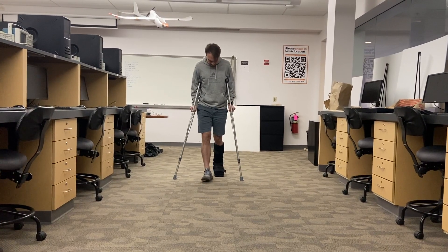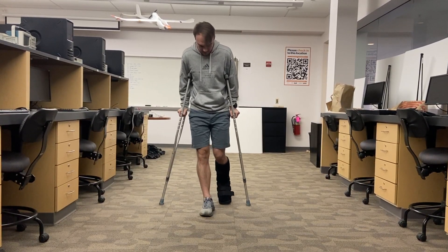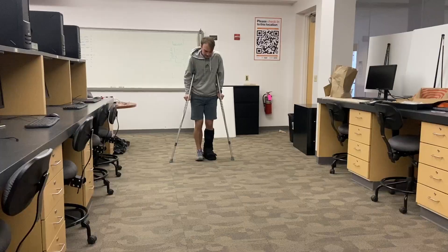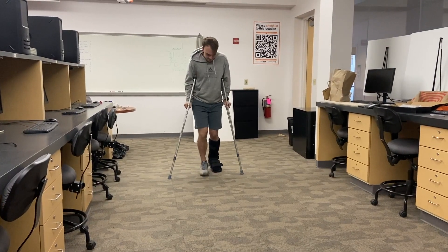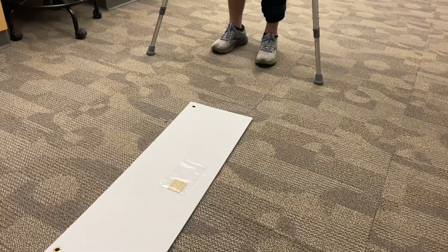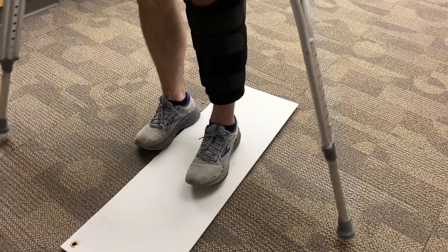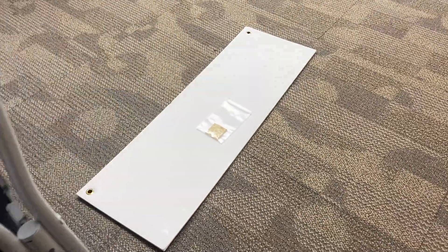While recovering from a lower limb orthopedic surgery, it's typical to return to full weight bearing status through a progressive increase in weight borne on the leg. A controlled return to full weight bearing status is critical to avoid re-injury of the affected limb. One popular process requires the patient to step on a saltine without breaking it. This method is pass-fail, which lessens its accuracy.